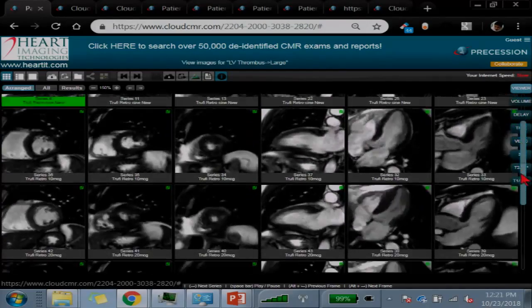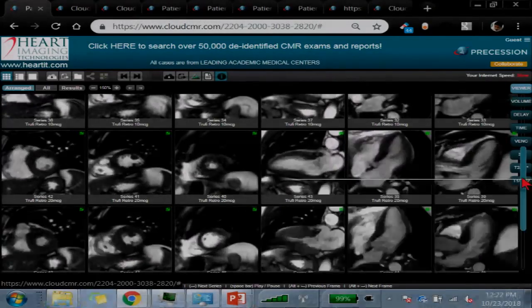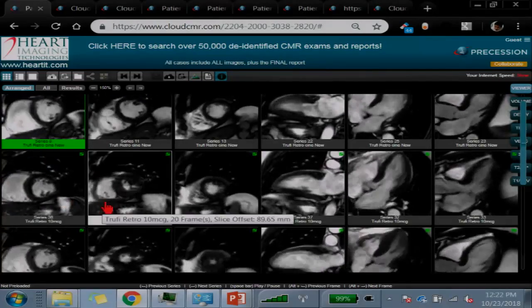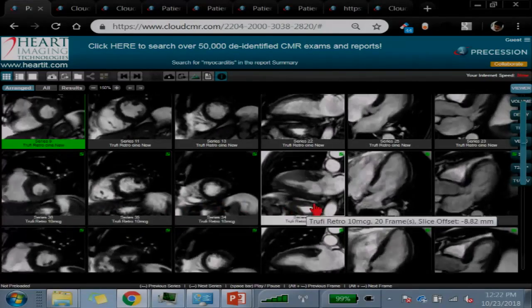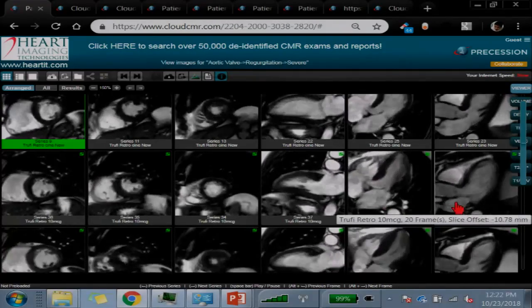Shown here is dobutamine being given at 10 micrograms. And you can see there's a little more augmentation in terms of contractility. And what do you guys think?